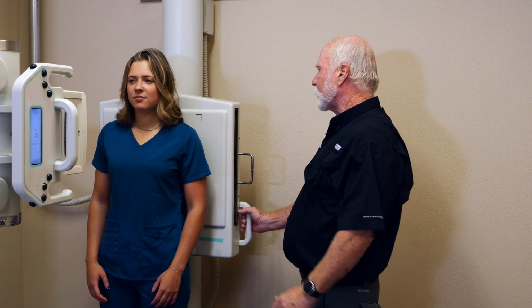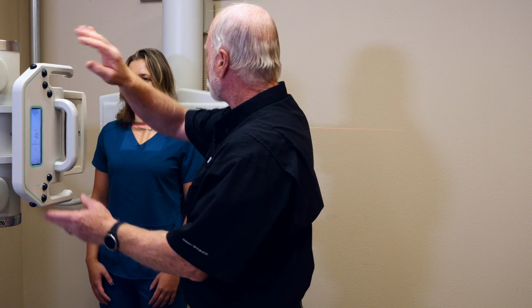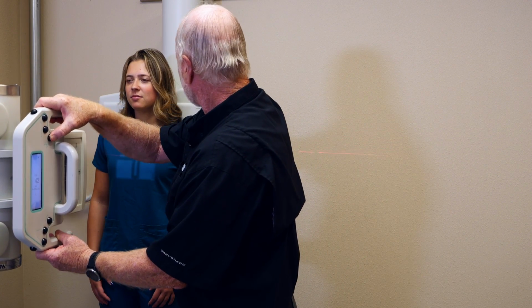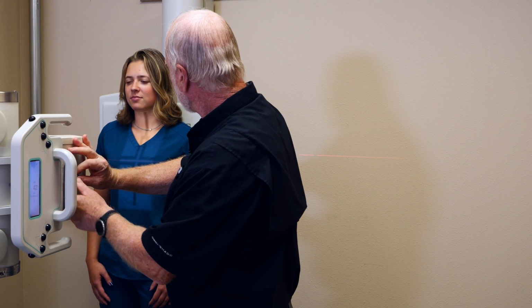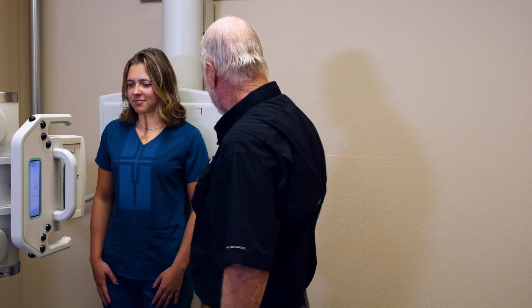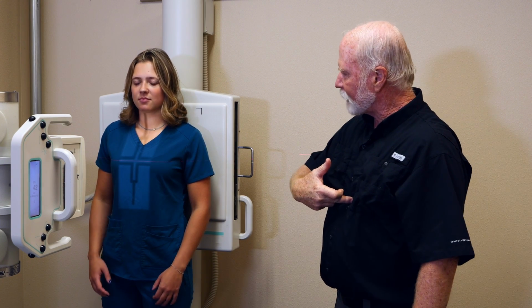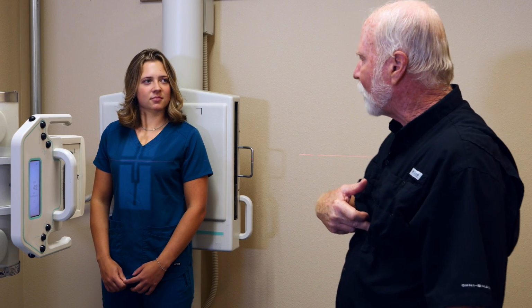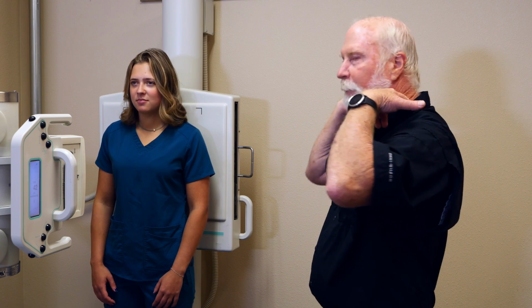So we're going to bring this up. We're going to go a couple inches above the top of the manubrium, the jugular notch. I'm going to open it up lengthwise. Keep it fairly narrow. Maybe step over me just ever so slightly. That looks good. And there's tons of room. If you'd point at your xiphoid process, that's about T10. We've got all the way down to probably L2 there. You've got plenty of room to work with on a T-spine. Just make sure you get that IR up high enough, or you're going to cut off T1.